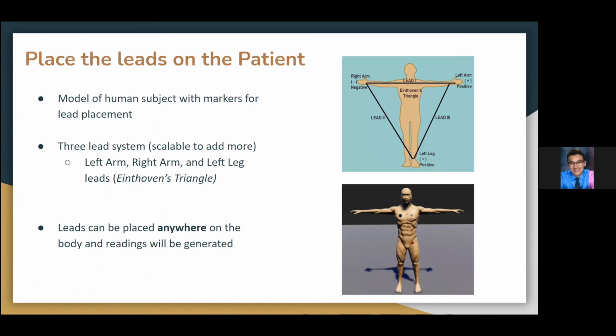If you make it like the simulations that have been made before, where you have a marker that tells you exactly where to put it and you can't put it anywhere else, then you're not really learning much. You're doing something that children could do, just putting blocks in holes. So we want it to be larger than that. We want people to be able to put leads anywhere and see in real time the output of your decisions.